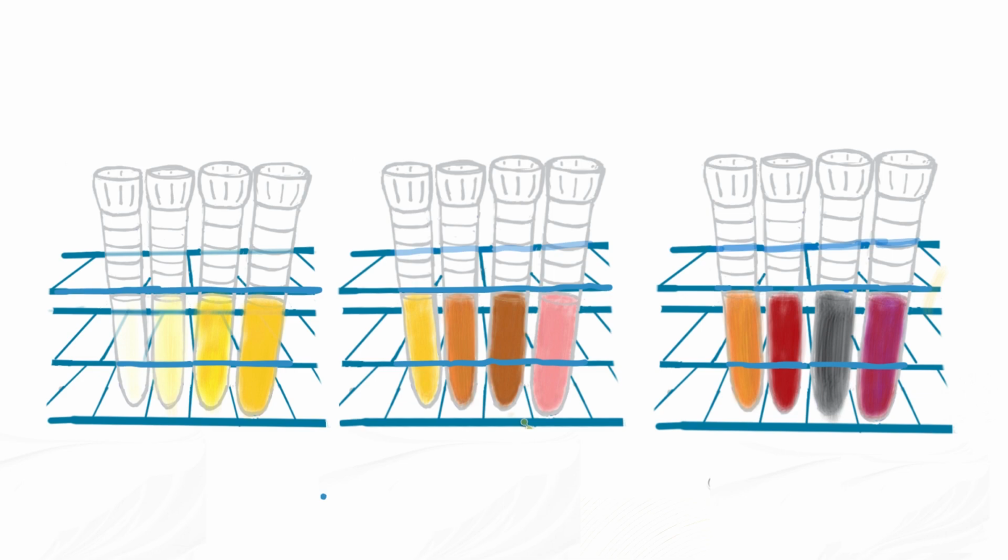A distinct and surprisingly noticeable change in urine color and appearance will often bring a patient to seek medical attention. The color of urine varies tremendously, from almost colorless to black. We'll explore these variations due to normal and abnormal metabolic functions, physical activity, ingested food, drinks, and medications, and some pathology.